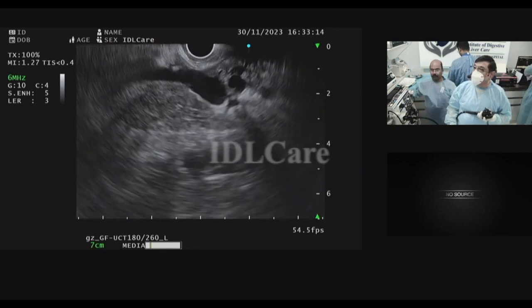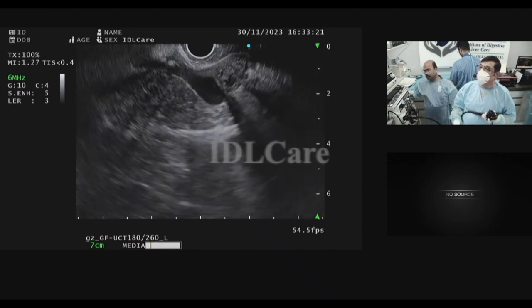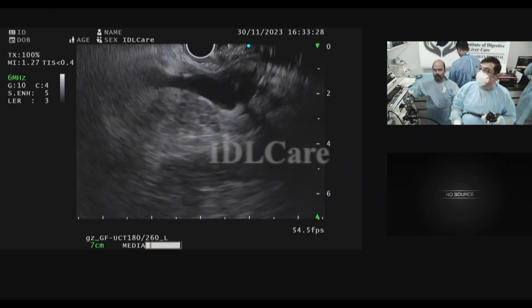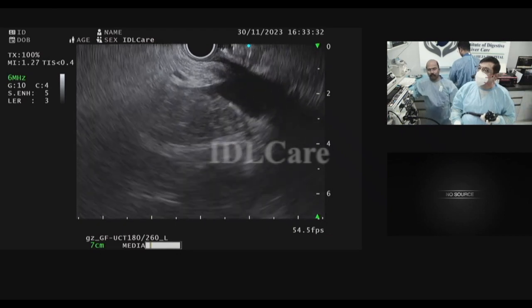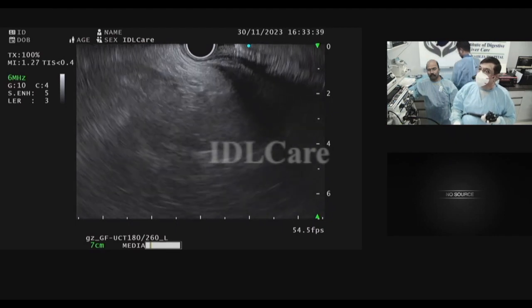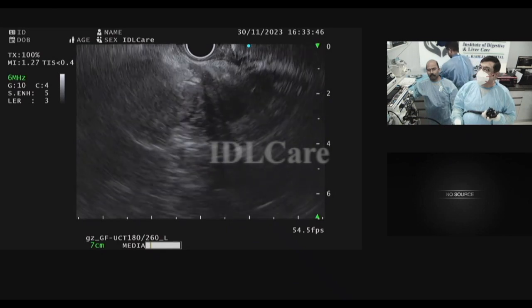The only patients where you will not find a good evaluation of the head are patients who have chronic pancreatitis and patients who are very obese, in which cases sometimes it is difficult. See, like this beautifully you can see the entire head. See that? Underneath you can see the IVC.